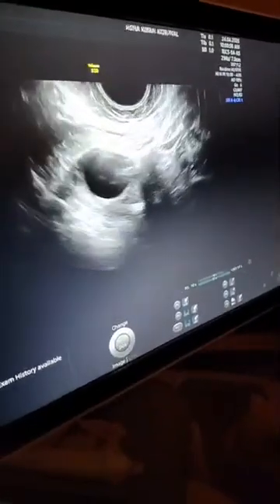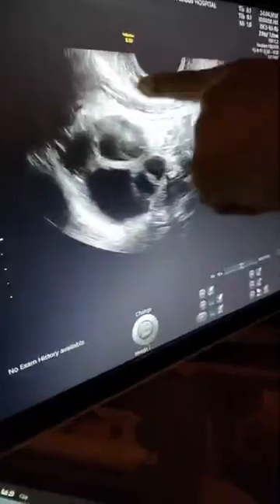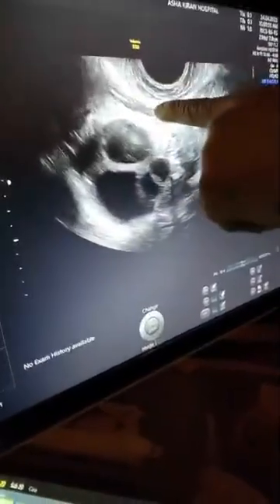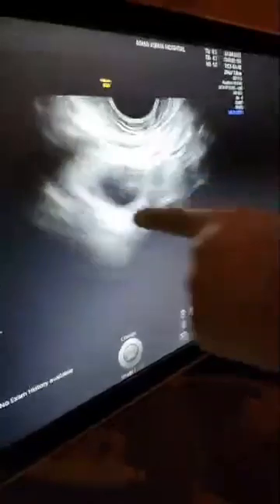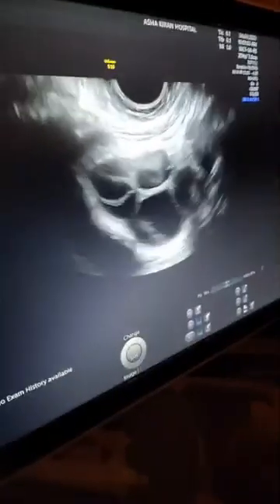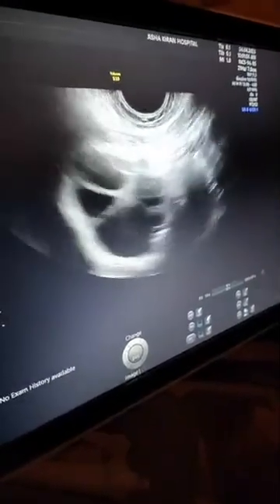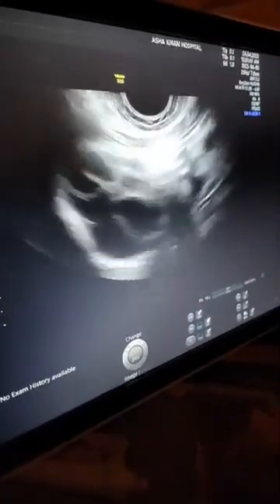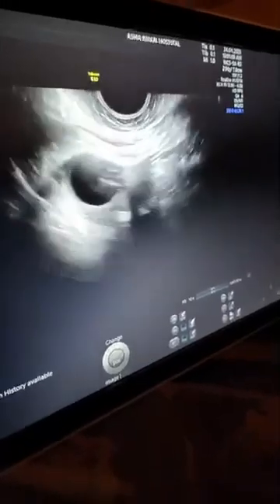You can see this is the abdominal wall, this is the fat of the abdomen, and this is the ovary. You can see there is no uterus at all. You can see this ovary and the external iliac artery here.